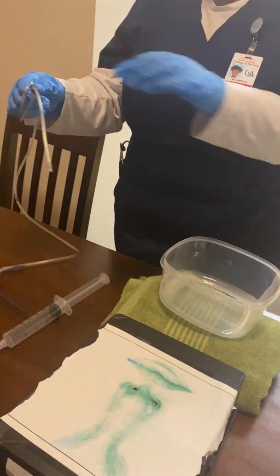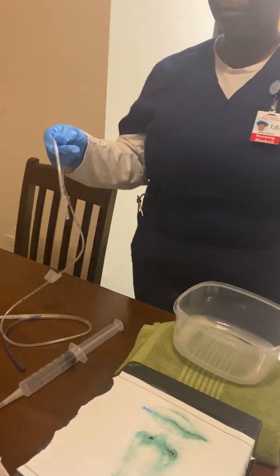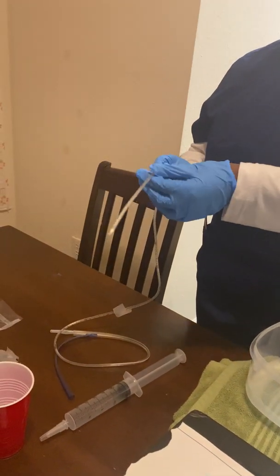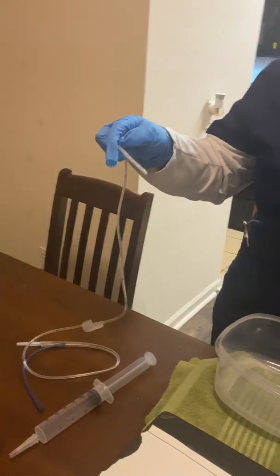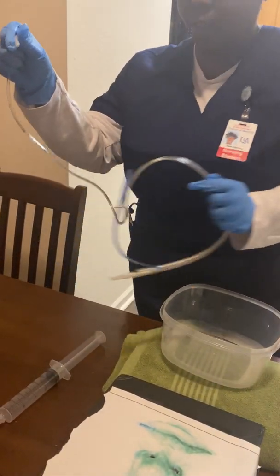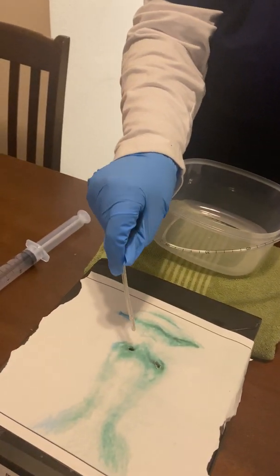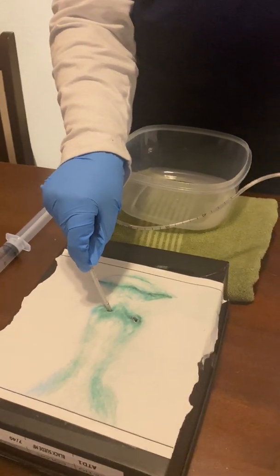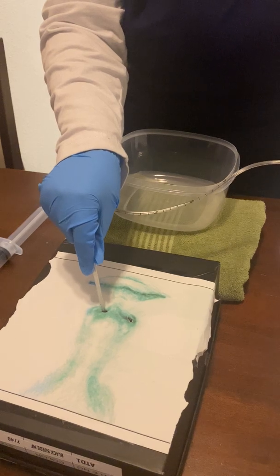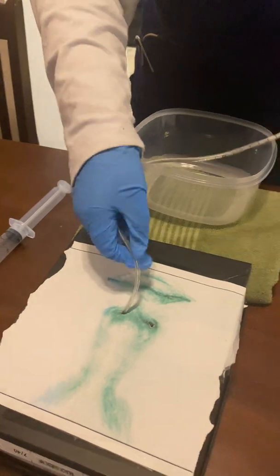So I'm going to take it, wrap it around, and let it go. I'm also going to state that I would lubricate the first 4 inches with the solution on my packaging. So now I'm going to get ready to go into my nose. So I'm going to come in here, and I'm going to have my patient tilt forward, and I'm going to be turning 180 degrees while I'm doing so.